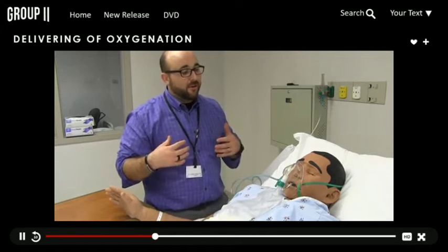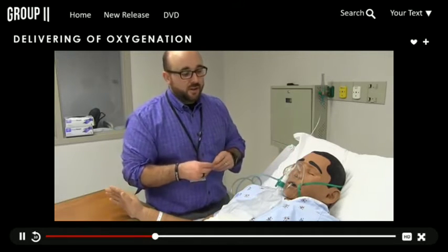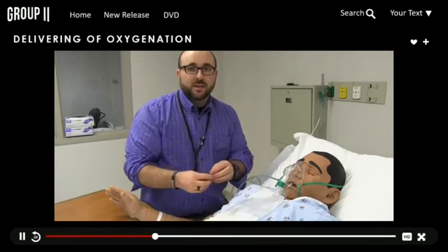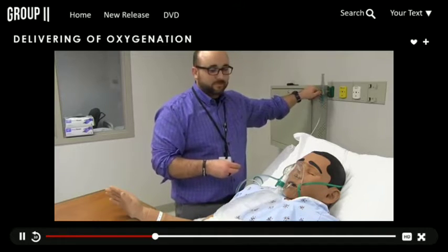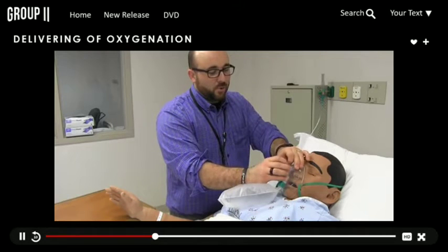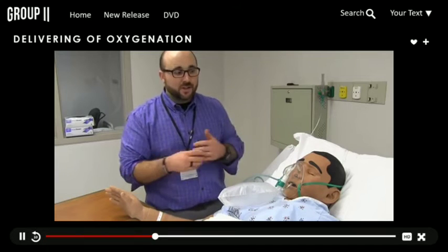So if they would ever want to consult a respiratory therapist or a nurse, they would just have some external air piped in to make this more realistic by having this inflated. So in real life, this is always inflated. It looks a little bit like this. And then you'll notice some little pieces of diaphragm that might be covering up these holes. What that does is it actually increases the FiO2 that you're delivering to your patient.